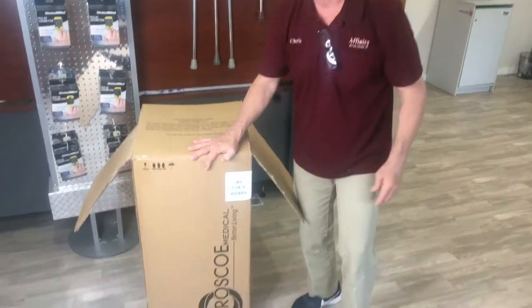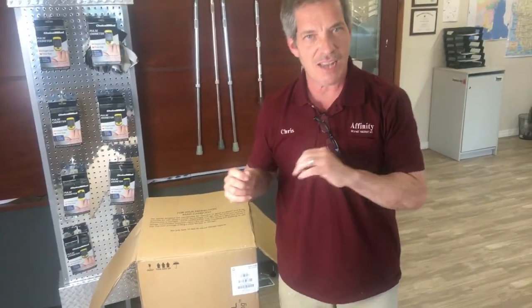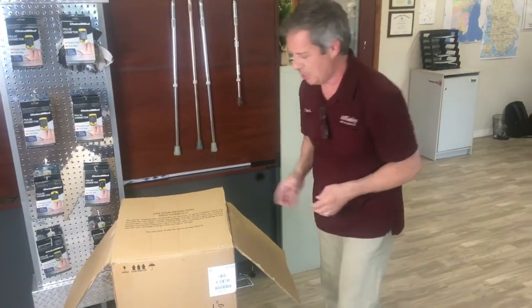Hi, I'm Chris with AffinityHM.com, and today I want to show you what you will receive when you order a knee scooter online from AffinityHM.com. You'll get a box like this from Roscoe Medical, and we wanted to do a video to show you how to get it out of the box and ready to go.